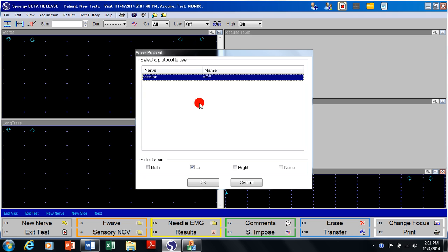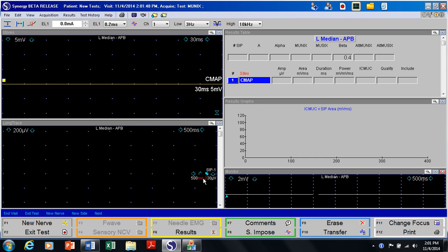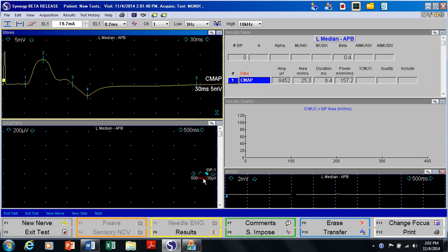This list shows only one muscle. You can add more muscles if necessary. We'll begin by recording the compound muscle action potential. So increasing the intensity and stimulate — here is a response at supramaximal amplitude, supramaximal stimulation.